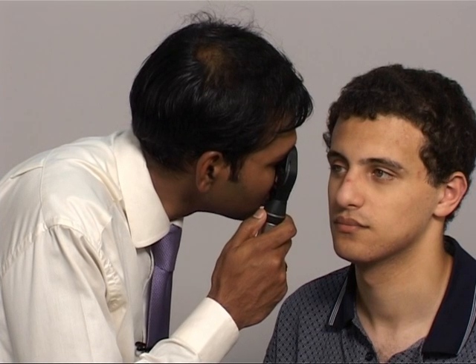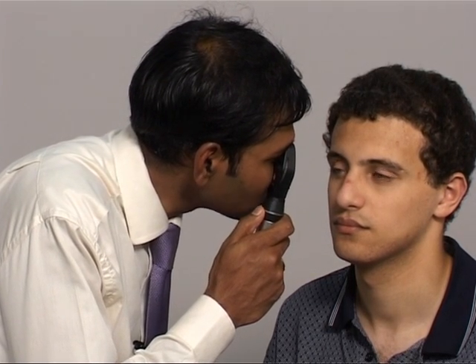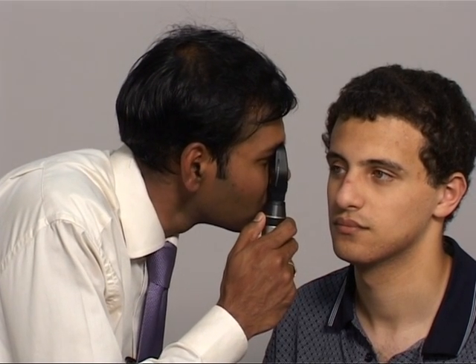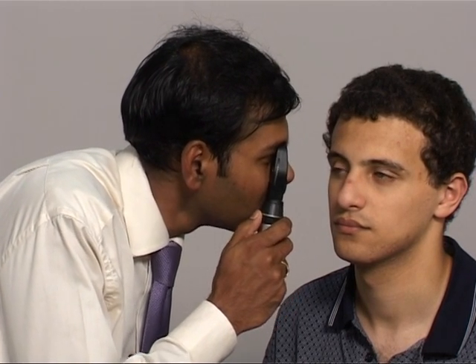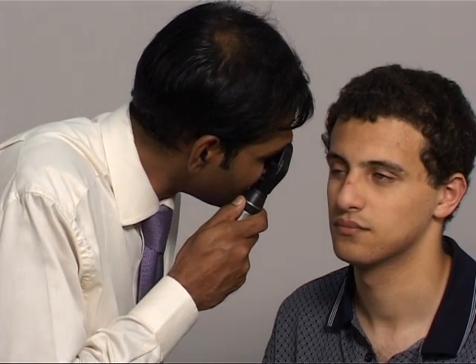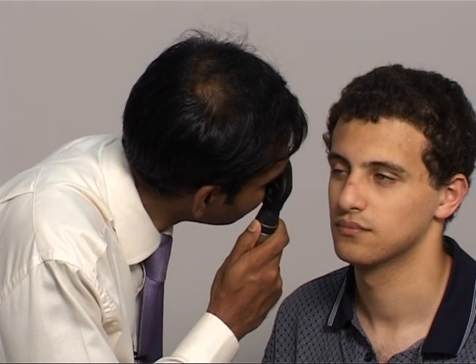You may want to study the appearance of the optic disc and then go on to examine the four quadrants by slightly tilting the ophthalmoscope to examine the upper nasal, lower temporal and upper temporal quadrants.